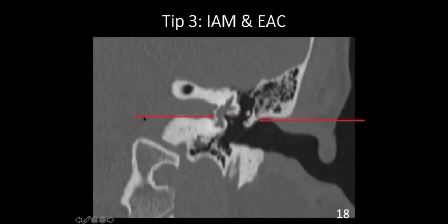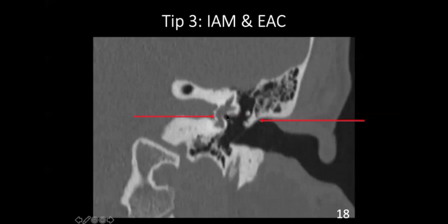The floor of the internal auditory meatus is exactly at the same level as the roof of the external auditory canal. This particular plane is very, very important. Going from outside to inside, one important structure is the lateral attic wall — this is one of the first structures which gets destroyed in cholesteatoma. Also at this level, the horizontal portion of the facial nerve is present — below the lateral semicircular canal, as you can see here.